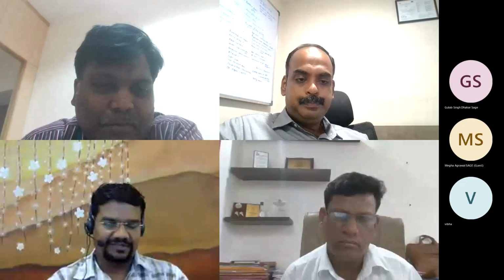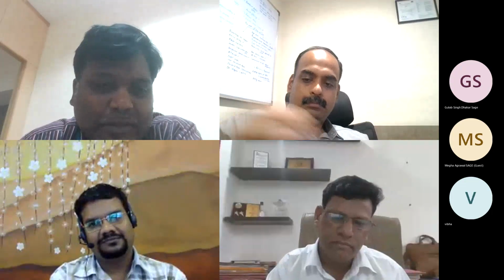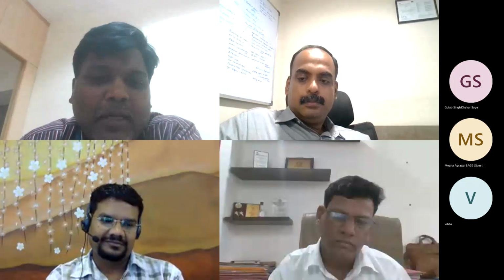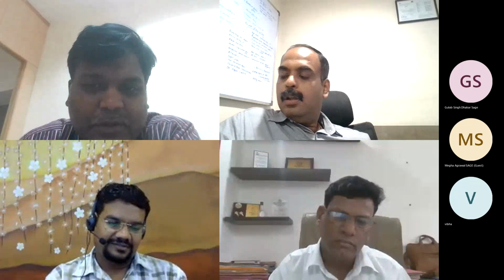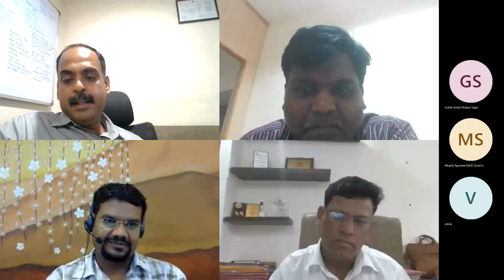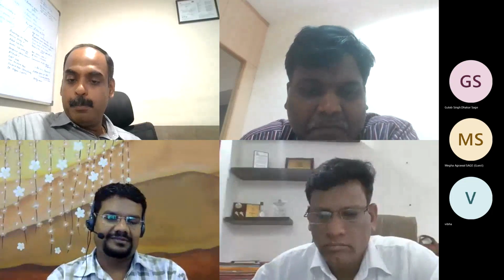Currently, we had a problem in Apollo. For the old hospitals, we are not able to integrate some of the modalities. Yes. Okay. We have to change those modalities, but Mumbai is a new setup. Older machines had this challenge because they were not mandating HL7 protocols; previously it was working on FTP methodologies to transfer data to notepads, and from there you had to fetch the data. Now that has gone. All the machines are compatible and follow HL7 standards, whatever we are using.